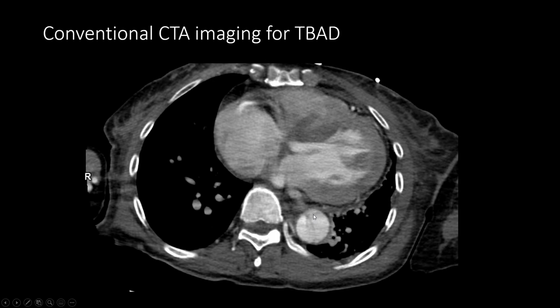Yeah. And this is what we typically base our diagnosis on. The reason I intentionally picked this slice is, if you look at your LV contour, there is a lot of haziness here. This is the septum moving with cardiac motion, and sometimes patient movement or respiratory motion. So there is a lot of motion artifact here.